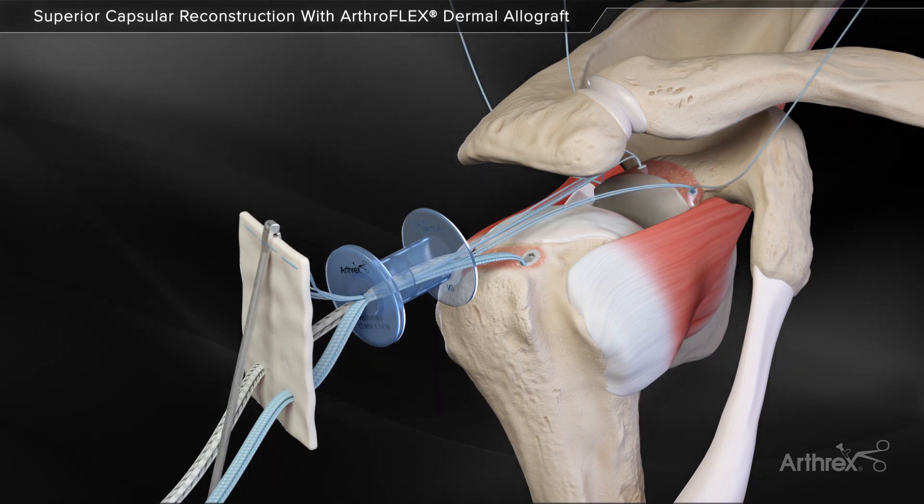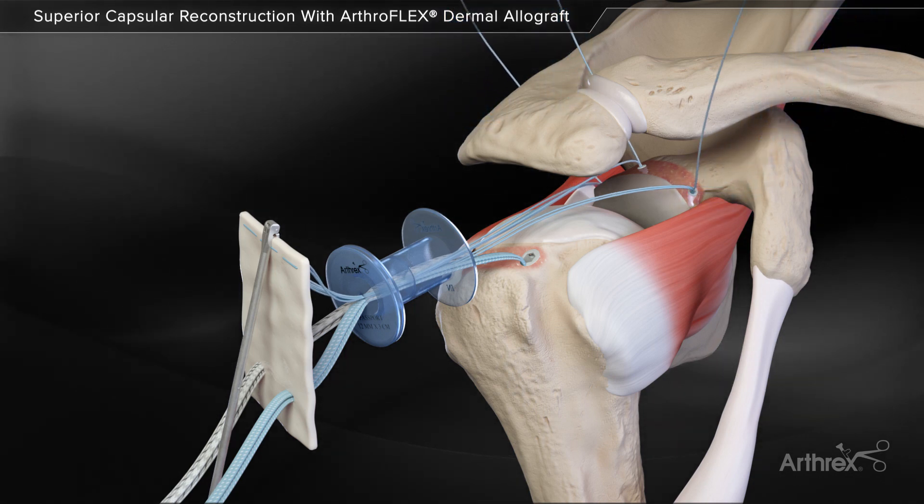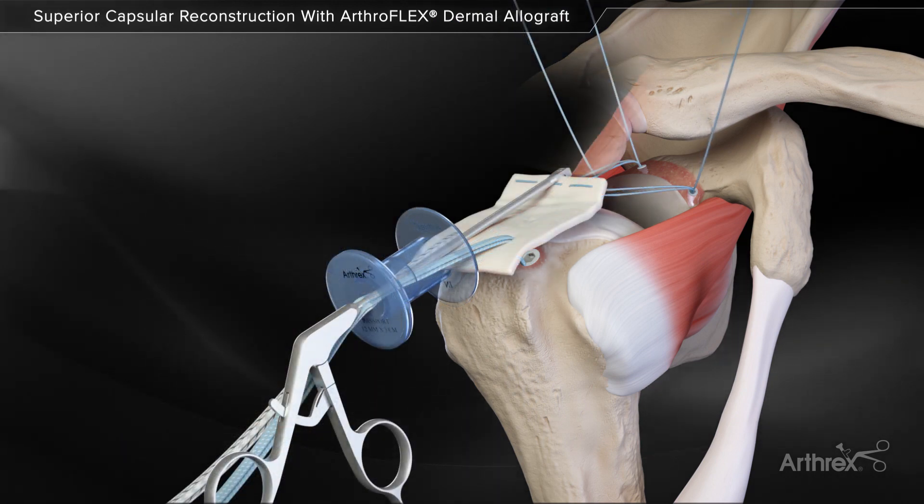Grasp the leading edge of the graft with the back grasper. Pull the graft through the passport cannula into position while systematically pulling tension on the three blue repair stitches to minimize slack in the suture.